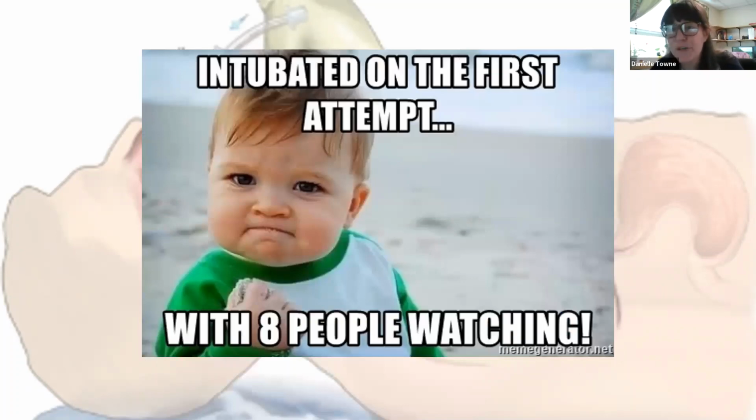All right, so really just as an overview from all of that, there's a lot of information there. Just set yourself up and your patient up for success by doing a thorough airway assessment, prepping all of your equipment, including your backup equipment, positioning yourself and your patient well, pre-oxygenating for at least 3 to 5 minutes before your attempt, creating your backup plans, making sure everybody's aware of them, pausing to ensure everyone's ready to go and knows their role and their job, choosing appropriate medications and doses, placing the ET tube and confirming it immediately, and managing the post-intubation phase of care.